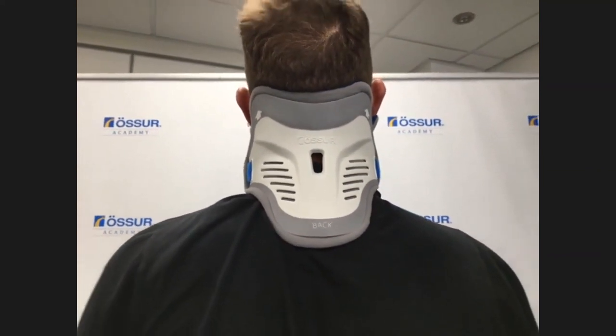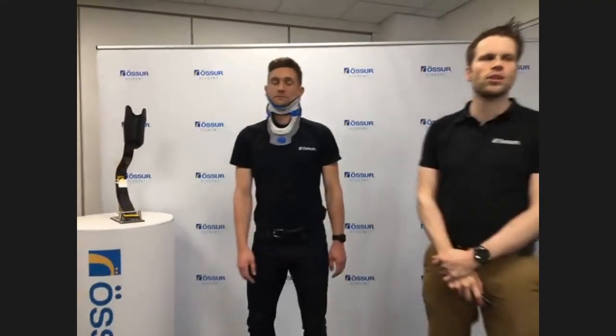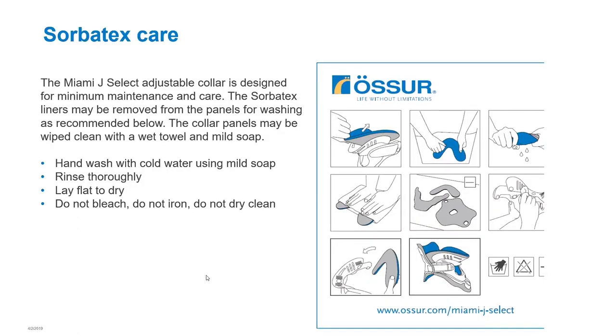Okay, so we're just going to cover a little bit about the washing and care instructions. So if we just go back to the presentation. With regards to the Sorbatex, it's designed to have minimal maintenance and care, but effectively for patient compliance, it's really important that you are washing the liners and checking the skin regularly.